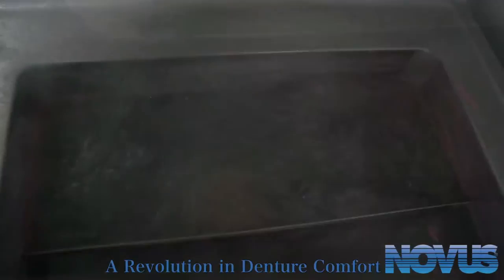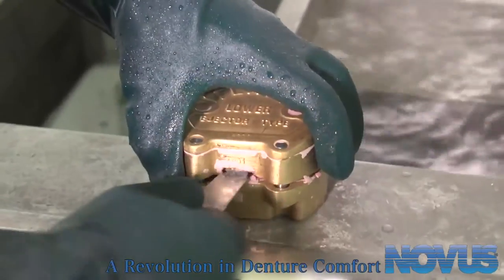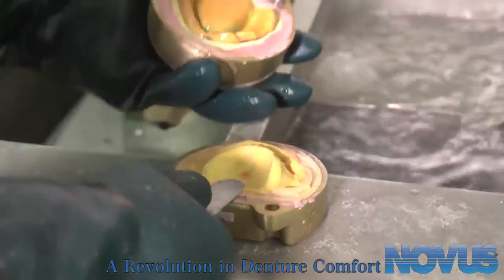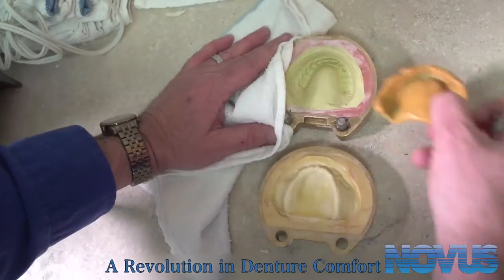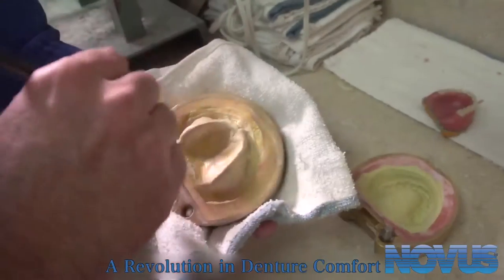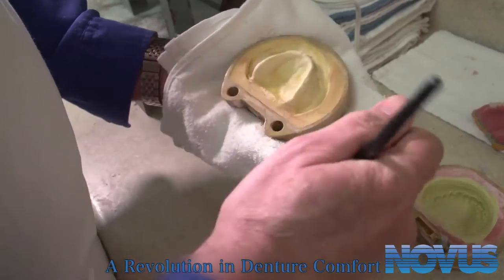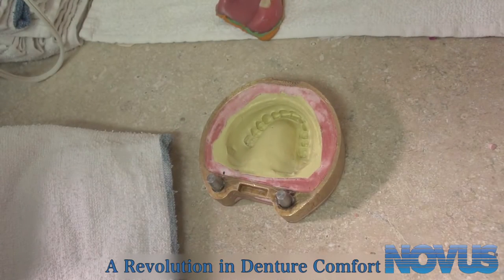Then, boil out the denture flask in clean water and take the denture out of the water. If putty was used, the denture should be removable from the investment. Paint both halves of the flask, including the cast, with tin foil substitute. Let the flask cool and dry.